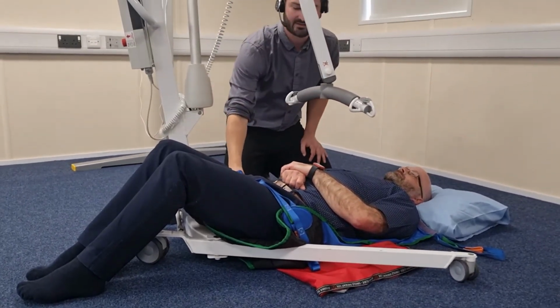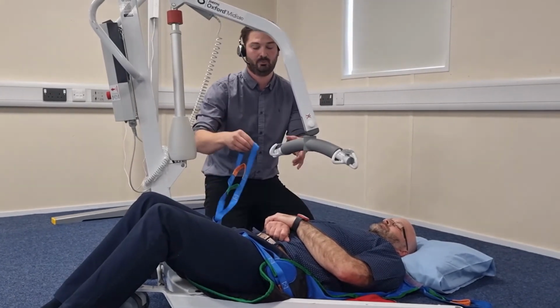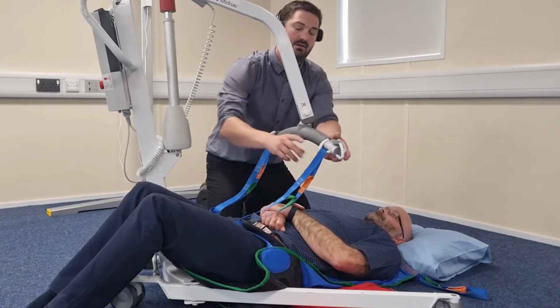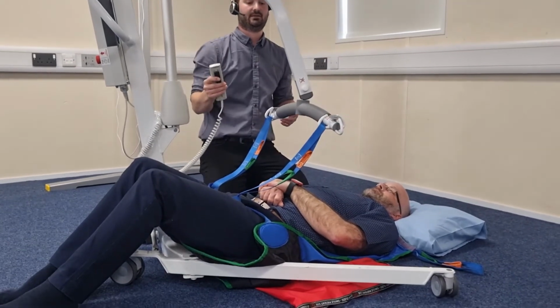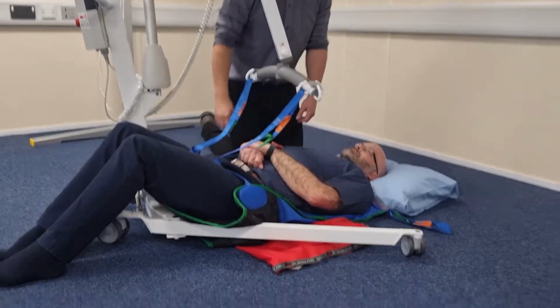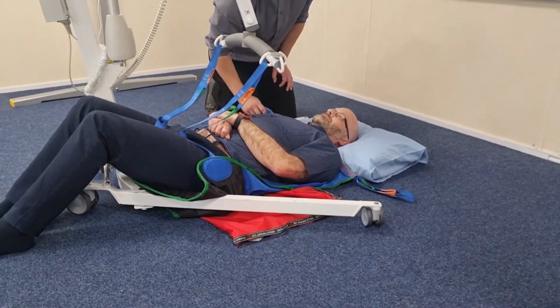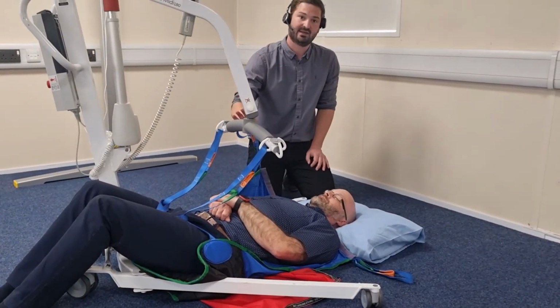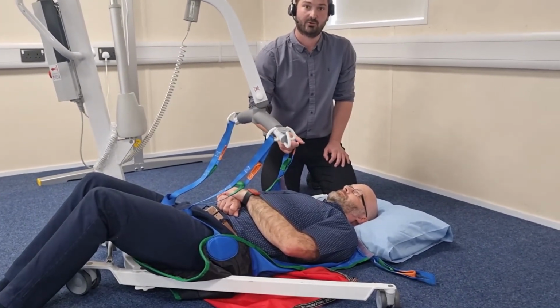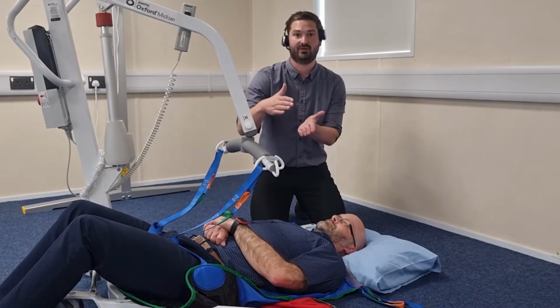So now I'm going to attach the sling onto the carry bar. I'm going to begin with the leg loops. It's also worth ensuring that your carry bar is as low down as possible. After I've fitted the lower part of the sling, I'm then going to fit the shoulder loops. So if I was to try and fit the shoulder loops as they are now, I'd be dragging and pulling the service user up to fit these. So I need to bring them closer to the carry bar.